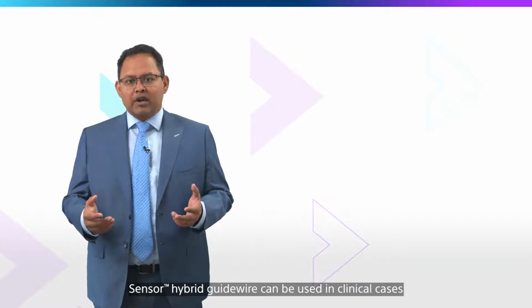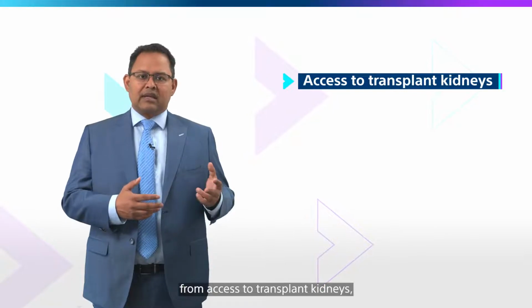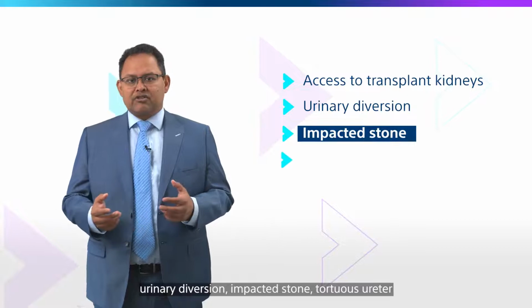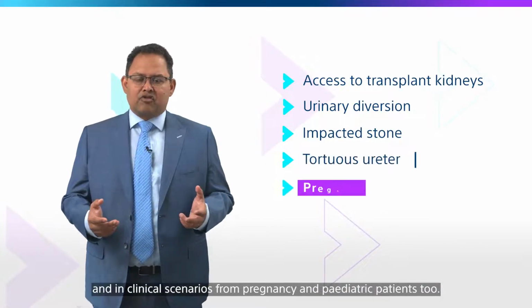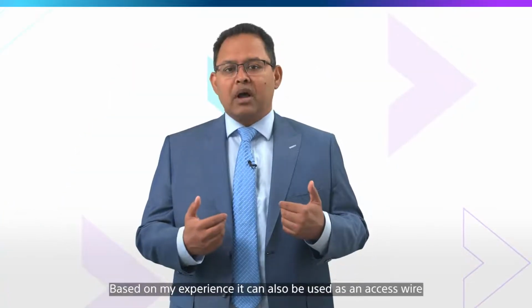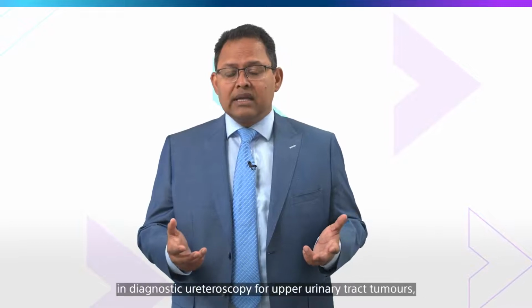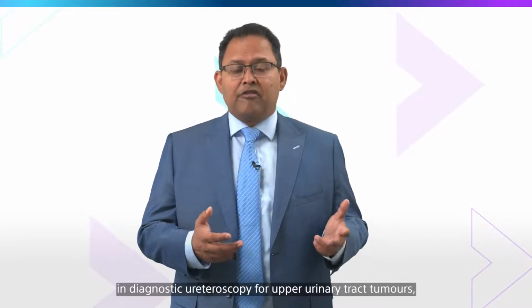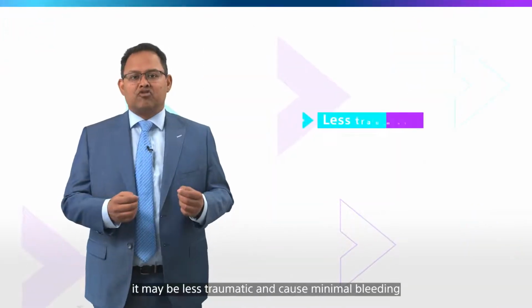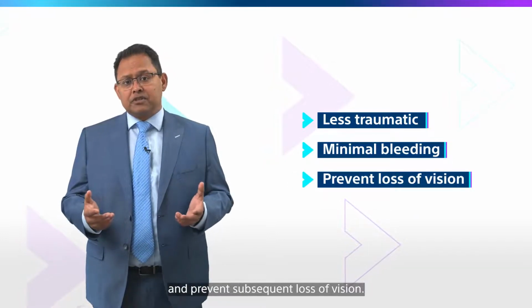Sensor hybrid guide wire can be used in clinical cases from access to transplant kidneys, urinary diversion, impacted stone, tortuous ureter, and in clinical scenarios from pregnancy and pediatric patients too. Based on my experience, it can also be used as an access wire in diagnostic ureteroscopy for upper urinary tract tumors, as having a flexible tip, it may be less traumatic and cause minimal bleeding and prevent subsequent loss of vision.